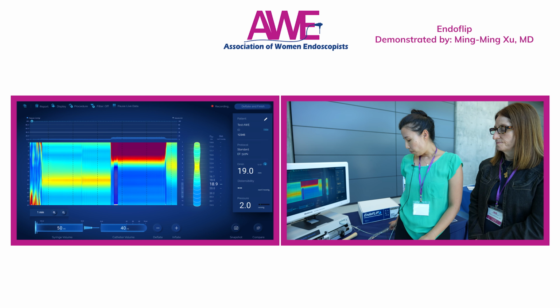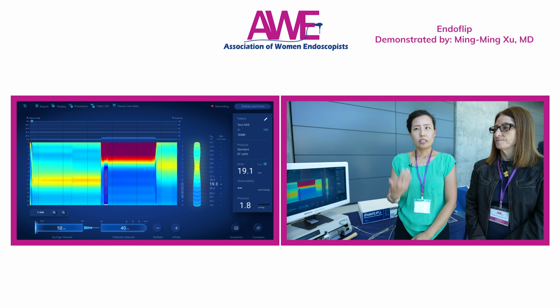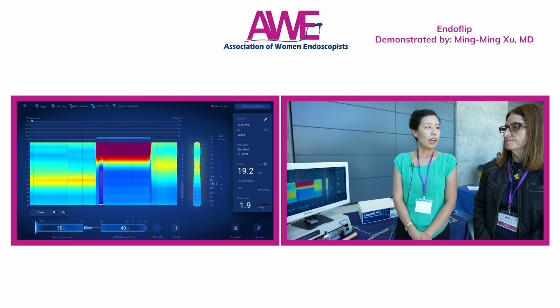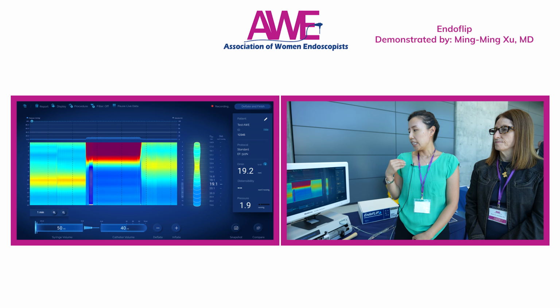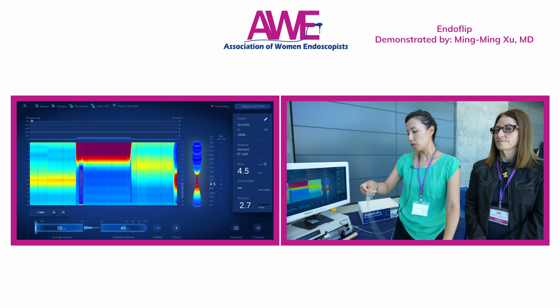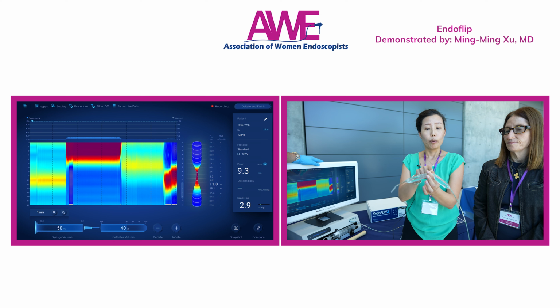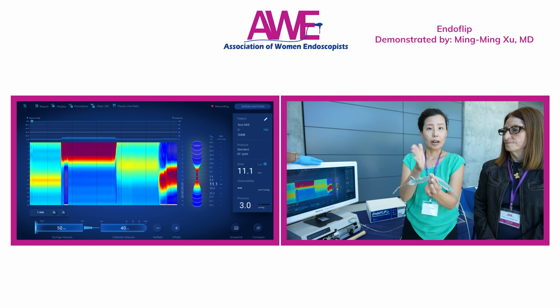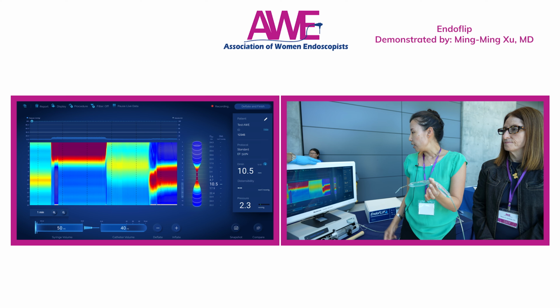This is a 16 centimeter balloon. There's also an 8 centimeter balloon. For POEM purposes, I generally just use the 8 centimeter balloon and inflate it to anywhere from 30 mils to 40 mils. And then the key measurement is, I'm going to use my hand as an example, you can see my hand is pinching the midpoint of the balloon. So this is mimicking where the lower esophageal sphincter would be.